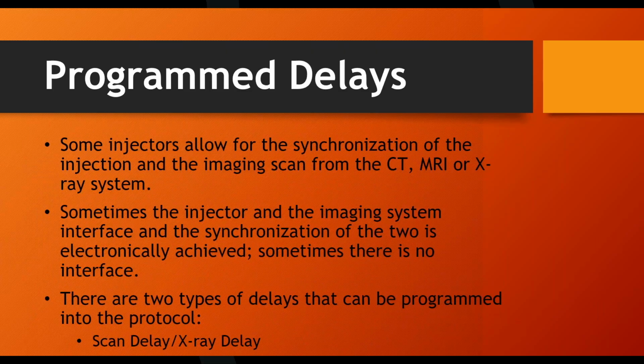So there are inject pauses, and there's CT. Oh man, what am I? What are we talking? Delays. Yeah, sorry about that. Scan. Man, I told you it's been a year. So there's inject delays and there's scan delays. Can't believe I forgot that.